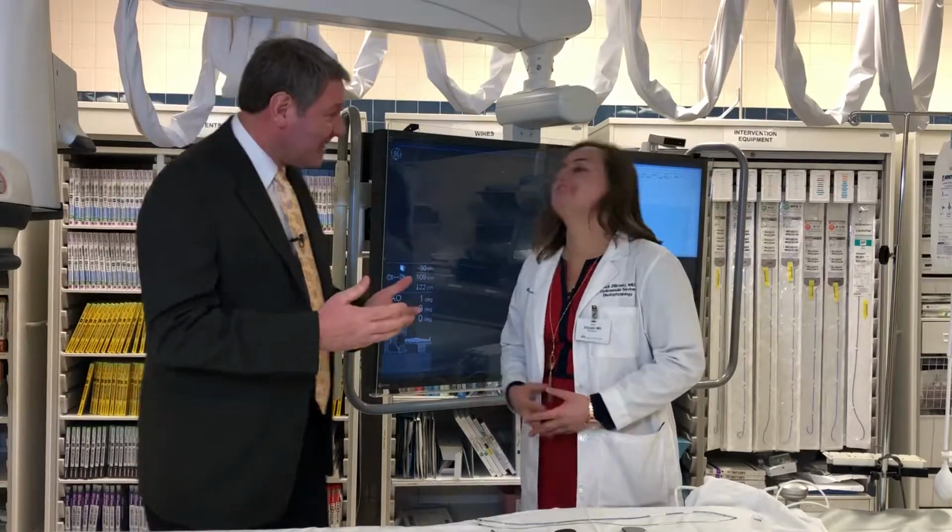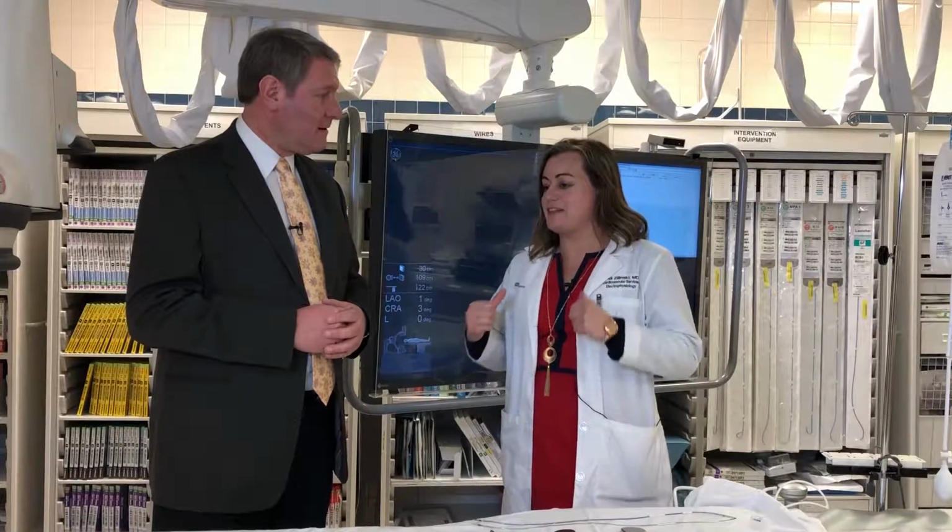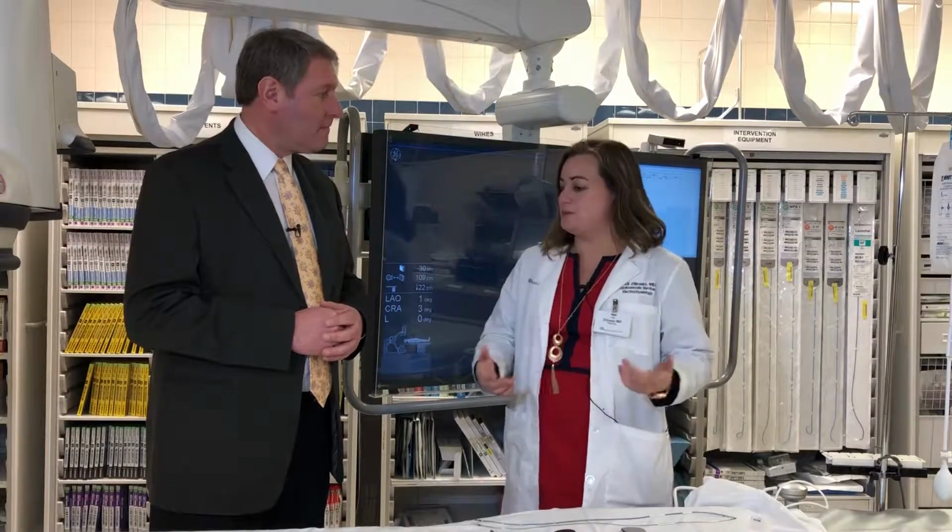All right, we've made our way to the cath lab. We're with Dr. Solinsky. Good to see you again. Tell us a little bit about the cath lab. This has been recently updated. Yes, we always try and get the newest equipment, the most updated fluoroscopy machines, which we use as an x-ray to guide us as we're doing either catheterization procedures for our cardiologist plumber colleagues or our electrophysiologist procedures where we put in devices.